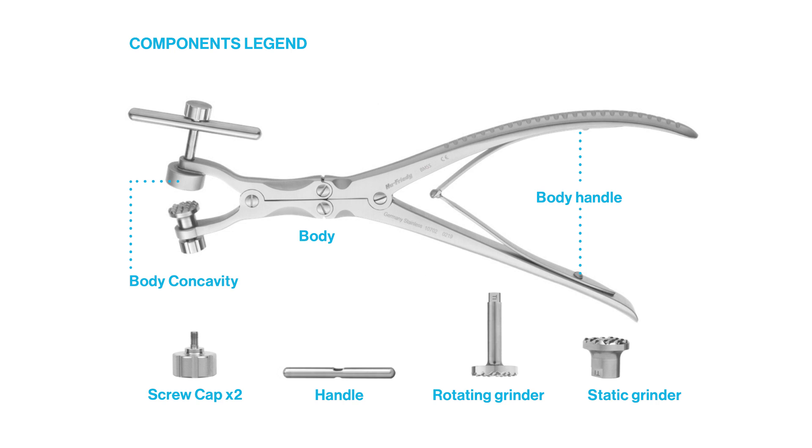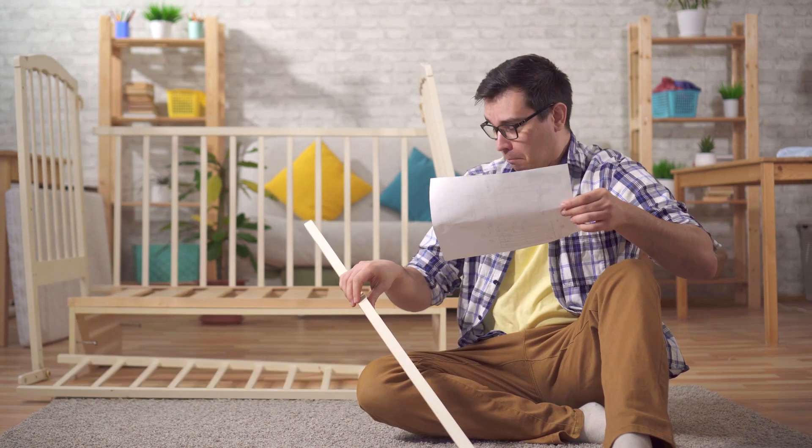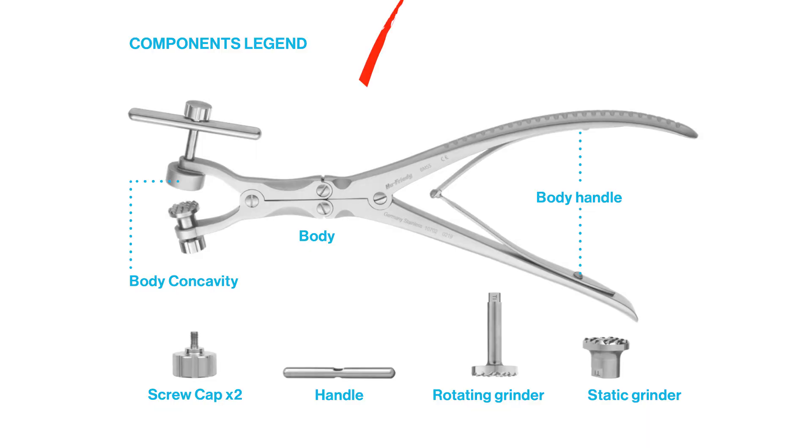When your double action bone mill arrives, you'll have to do a bit of assembly. Don't worry — this won't end up like your first Ikea TV stand. In addition to the body assembly, there are just five parts to put together: a static grinder, rotating grinder, handle, and two screw caps that attach the parts together. You can assemble it in just a few minutes and give it a try.